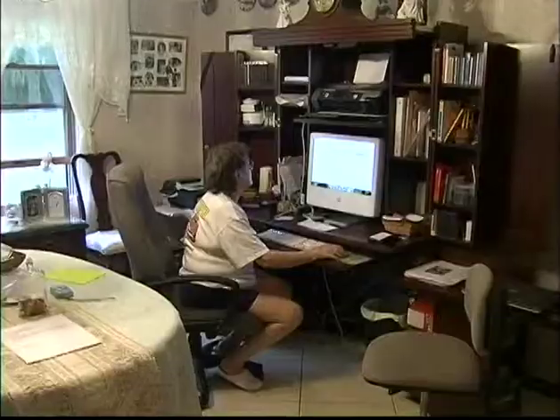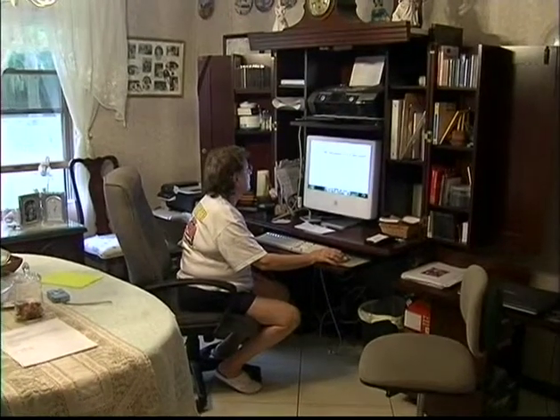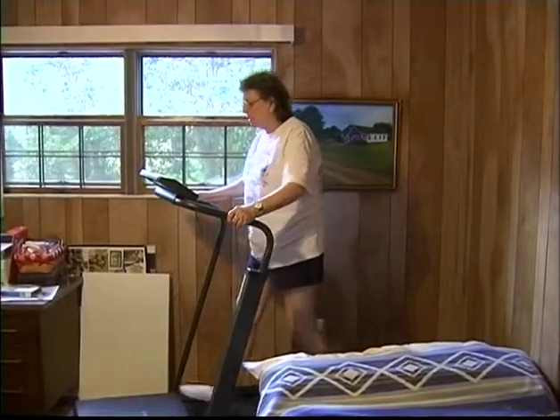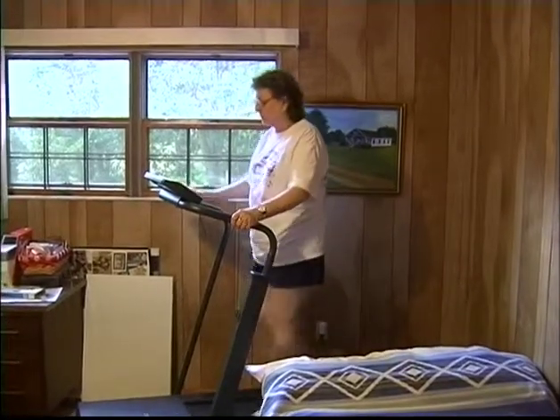If we can get to the education component with patients and helping them understand all the benefits that come from wearing the device, everything from a better quality of life, it could alleviate the daytime sleepiness, better mood, possibility of actually having the energy to exercise, which would then lead to some weight loss.